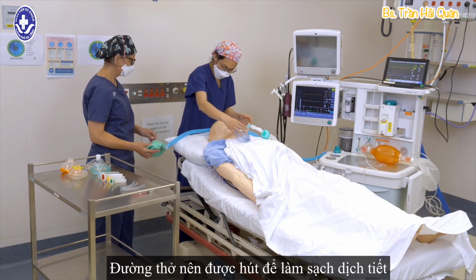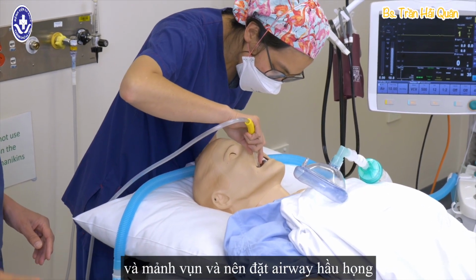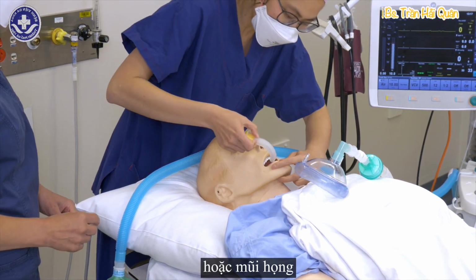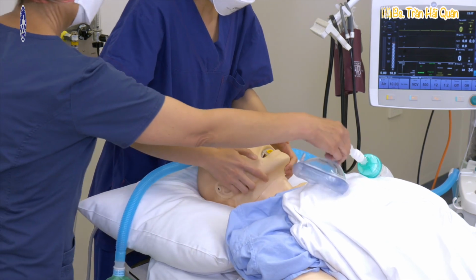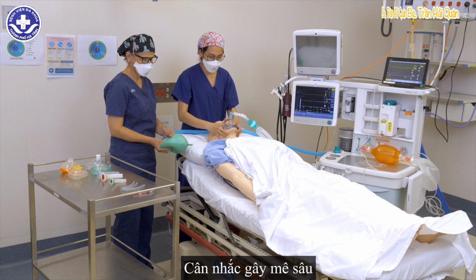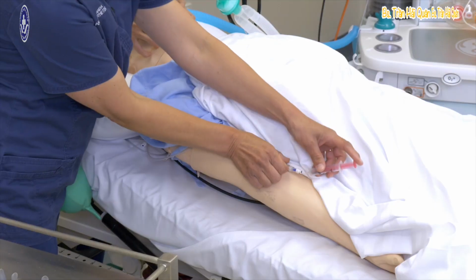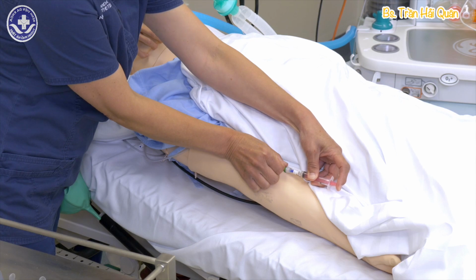The airway should be suctioned to clear secretions and debris, and an oropharyngeal airway or nasopharyngeal airway should be placed to optimise airway patency. Consider deepening anaesthesia or adding muscle relaxation, particularly if you think laryngospasm might be the problem.